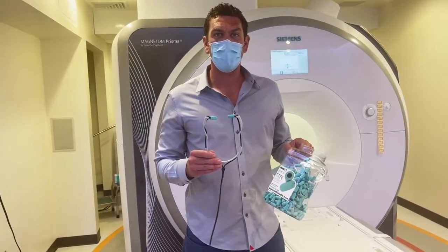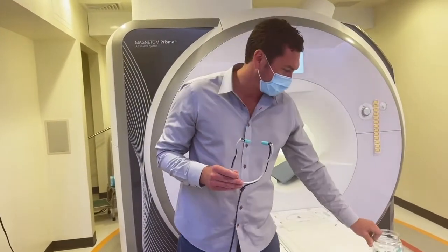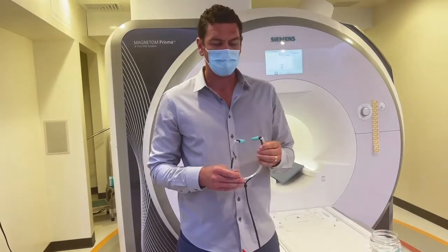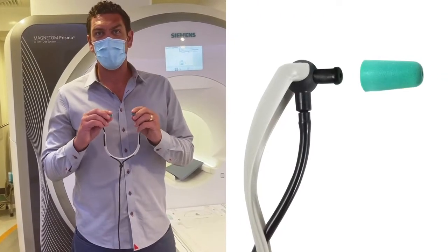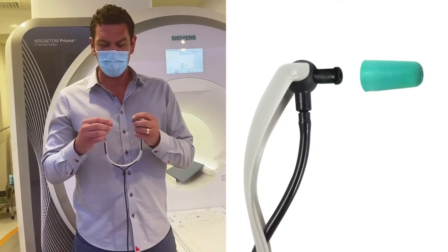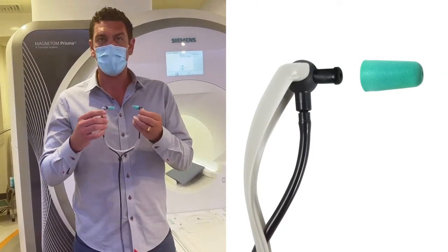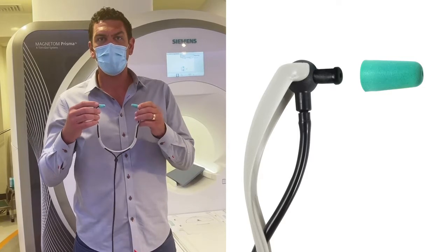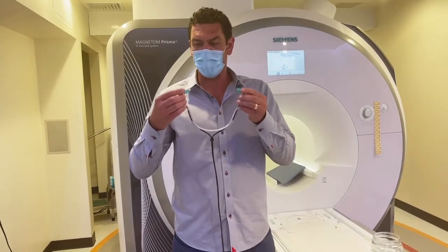The in-ear headphones use disposable ear tips. You want to change these out for each patient for sanitary purposes. To insert the ear tips into the patient's ears, you want to pinch down on them to compress the foam. The foam will rebound to its original shape in 30 seconds.